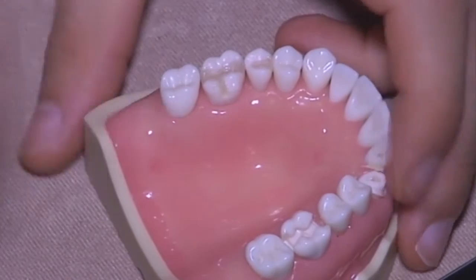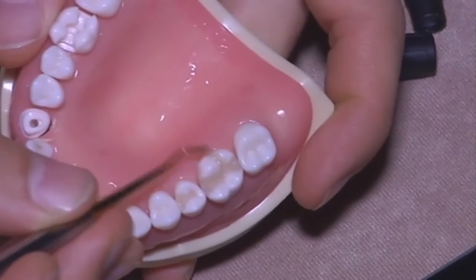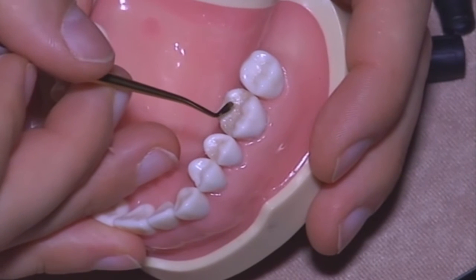And we just need then to finish and polish it, which is a key point of restorations, always the finishing and polishing procedure.